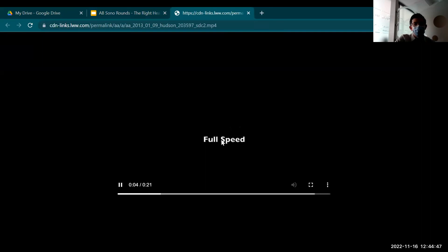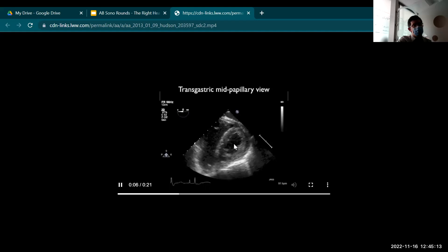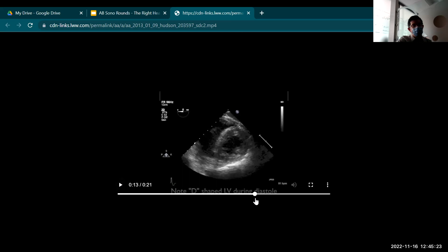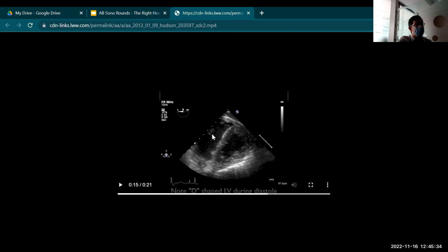Looking at these clips: I put my marker on the screen and track systole. As this wall comes in toward systole, where's the septum? The septum is flattening in systole — that's the first example. In the second clip: in systole the septum goes out, and in diastole is when it goes flat. So in systole it's round, and in diastole the ventricle is filled and the septum is flat — that is RV volume overload.